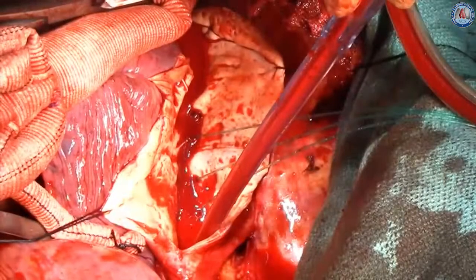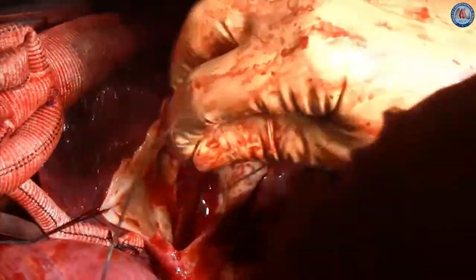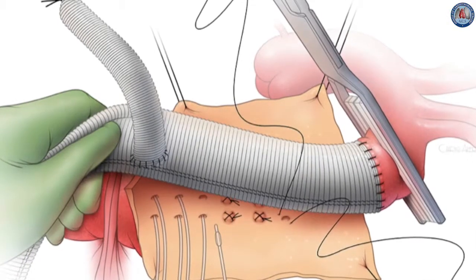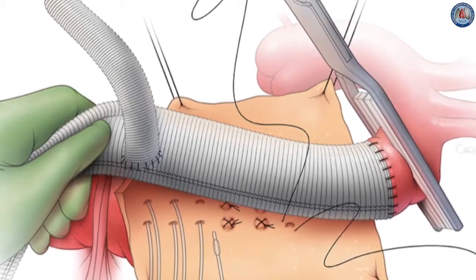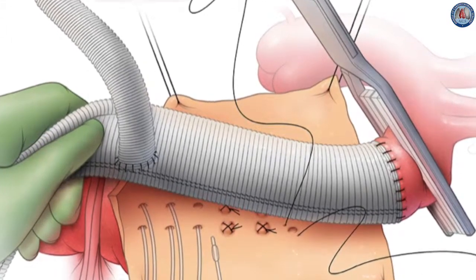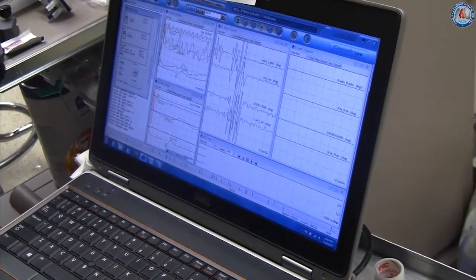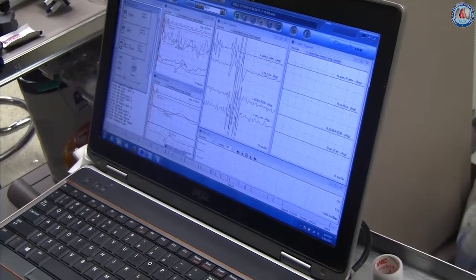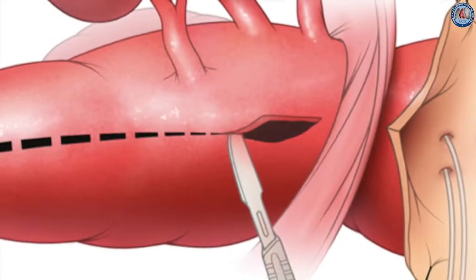After completion of the proximal anastomosis, the descending thoracic aorta is opened and intercostal arteries number 8 through 12 are occluded using balloon catheters. Motor evoked potentials did not change, and attention was then turned toward the abdominal segment.